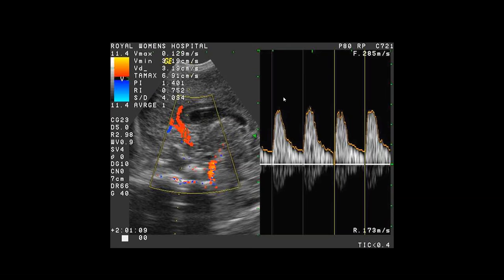The next thing is to look at the cerebral pulse waves and the anterior cerebral artery. So you place the Doppler and you should trace out the Doppler waveform, and the resistive index should be somewhere between 0.6 and 0.8. The pericallosal artery, that's your anterior cerebral artery. Then coming in is your basilar artery.